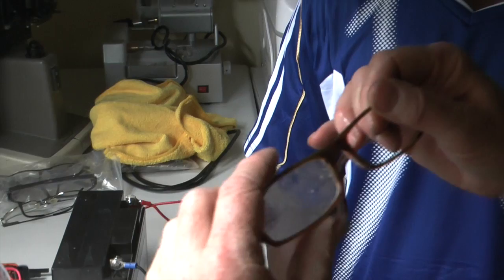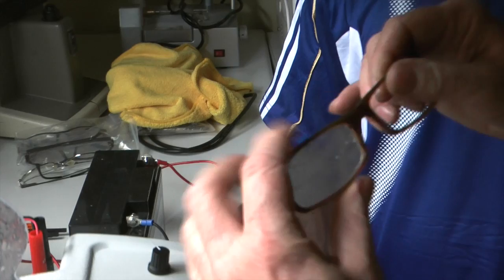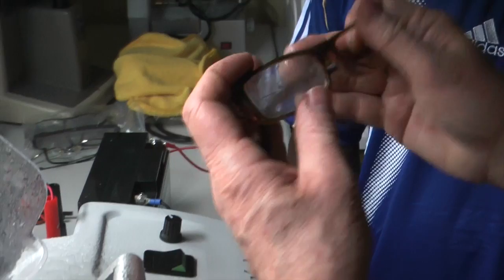We're just going to check and see if it fits the frame - and it fits very nicely. That's one lens done; you can see it didn't take very long. But it's a machine that needs lots of practice. It's done the job, so that's great.